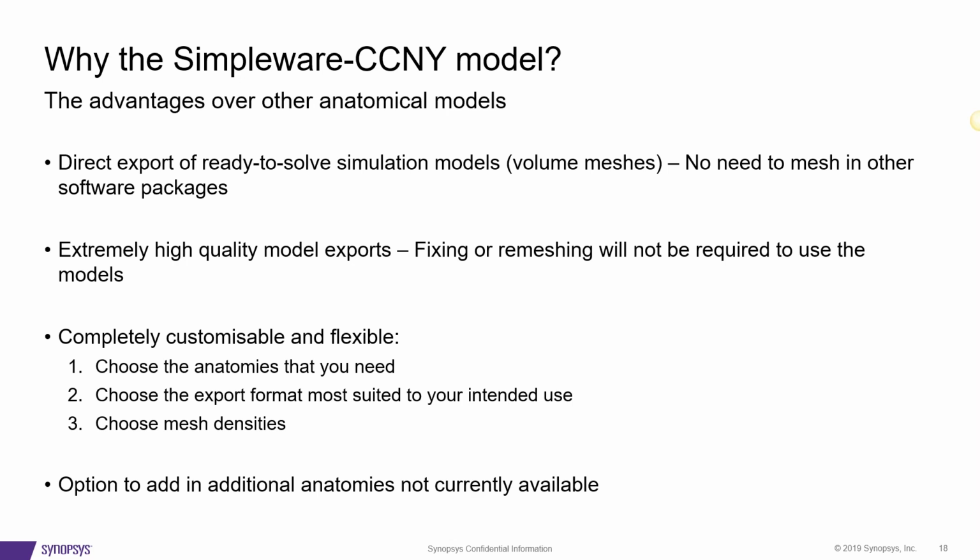The exports we deliver are extremely high quality, meaning you don't need to fix or remesh the model to make use of it. As long as you're able to communicate your requirements to us directly, the models we deliver should be ready for use in your application.